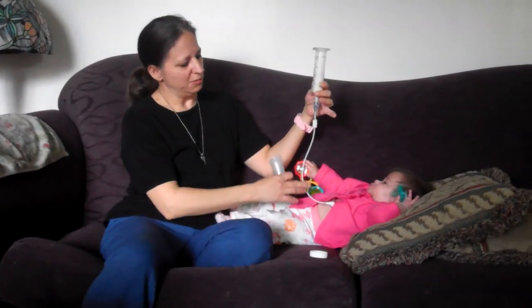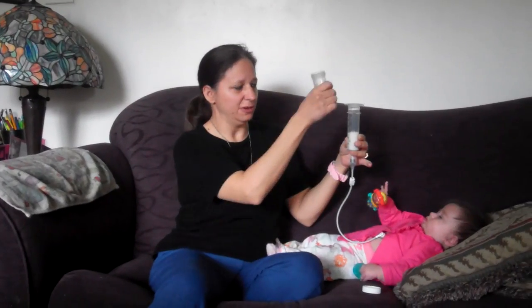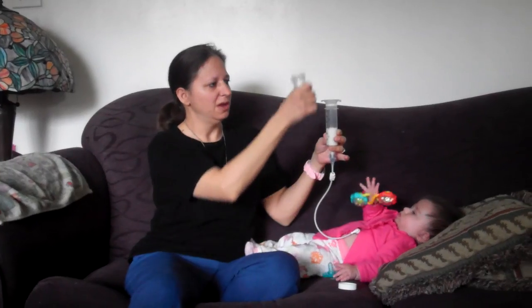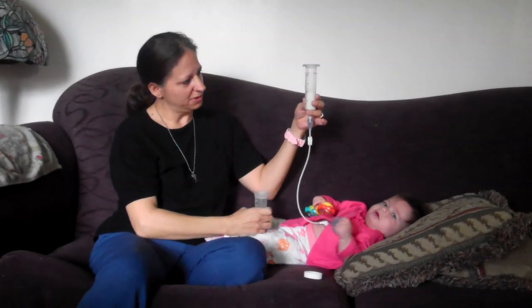And once in a while, when she'll push something up in here and make it stuck, no one told me to do this, but sometimes I'll just give it a shake. And it seems to loosen up in there, and then it will start to flow again. But then again, you do have the, I forget what it's called. I call it a plunger, but we rarely use it. And that will just be something you insert in there, put a little bit of pressure to get that flowing again.